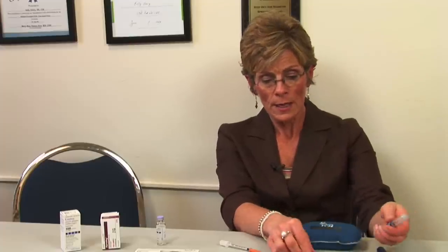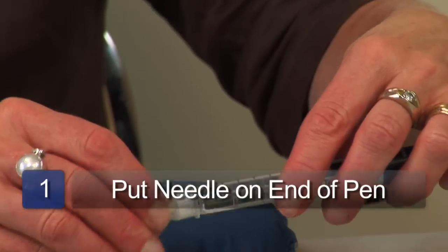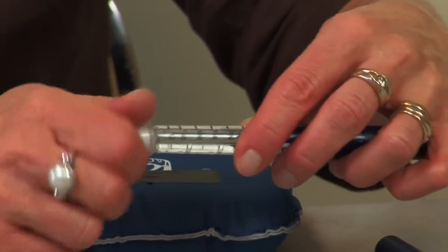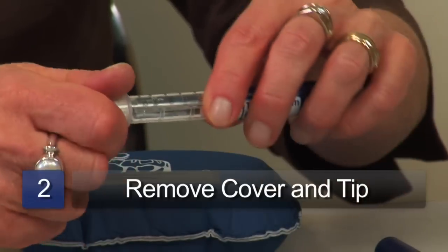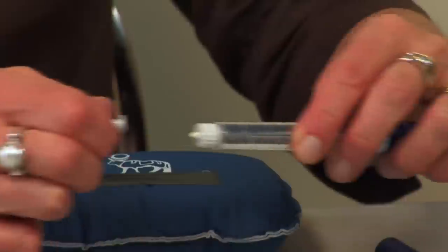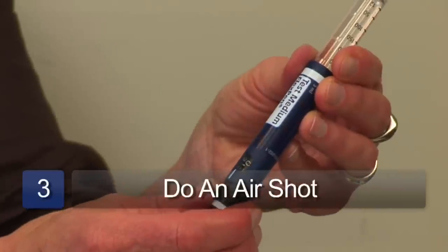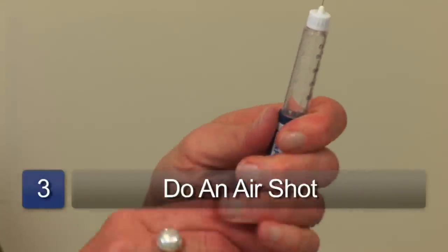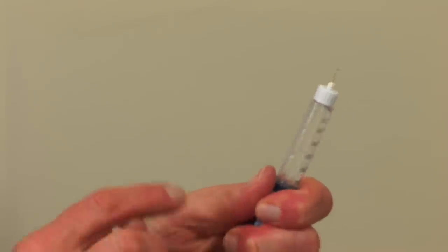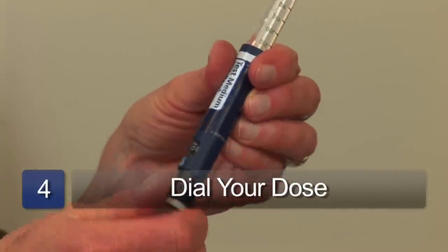The way these pens work is you put a needle on the end of the pen, take off the cover, take off the tip, and then typically we do what we call an air shot — we dial one to two units of insulin, hold the pen upright, flick any air that might be in the pen up, and then squirt that off. If we see a good stream of insulin, we can dial our dose — if I need ten units, I would dial it to ten and then inject myself.